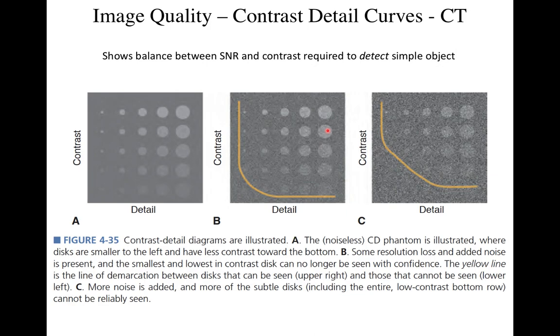It turns out that in two dimensions, when you look at how the signal decreases as these disks get smaller, it is proportional to the 2D point spread function of the object. As the diameter of the disk goes to zero, its measured contrast also goes down. Although they don't demonstrate it here, as you go farther and farther, it goes to zero. You can actually just plot out the point spread function with the amplitudes of these.